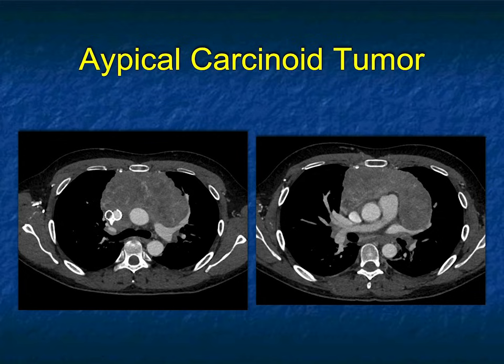This was a carcinoid tumor. In the differential I think you could do very well, but this patient needs a biopsy. This is not going to be a resectable tumor, as there is diffuse infiltration, involvement of the pulmonary artery, and encasement of the aorta.